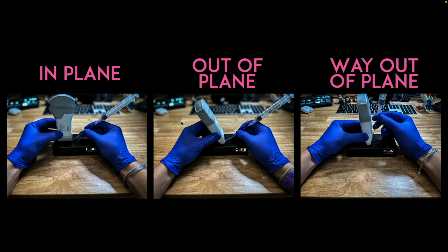With regards to aspiration or injection of really any joint, there are three different approaches: in-plane, out-of-plane, and way out-of-plane. For the most part, in-plane is going to give you the best visualization. Out-of-plane works very well if you have a lot of structures around the area you want to cannulate, aspirate from, or inject — it's also my favorite technique for peripheral ultrasound-guided IVs. And sometimes when you have a very small space, you might want to do a way out-of-plane technique where you identify midline and go straight down, knowing you won't have great visualization of the needle tip.